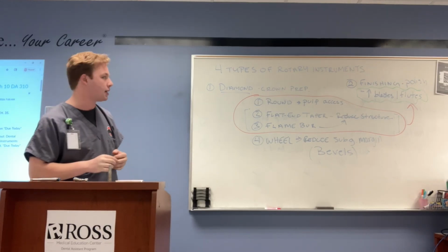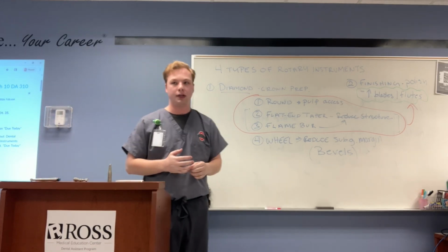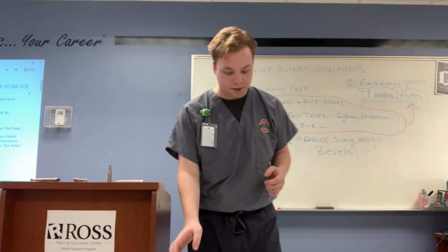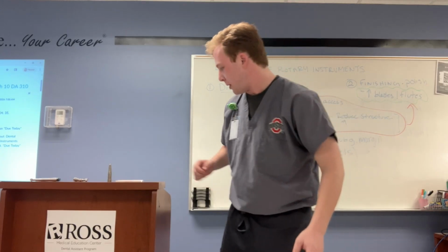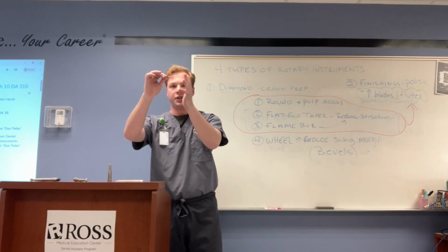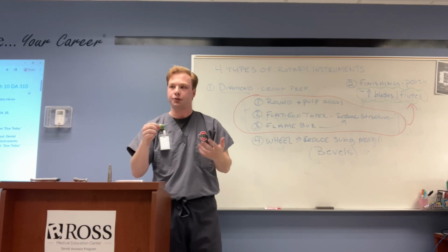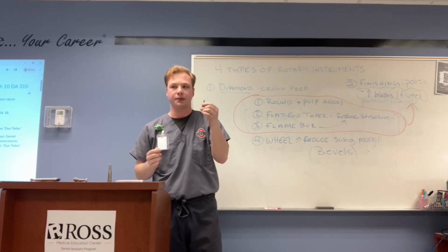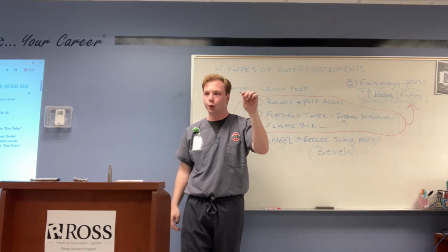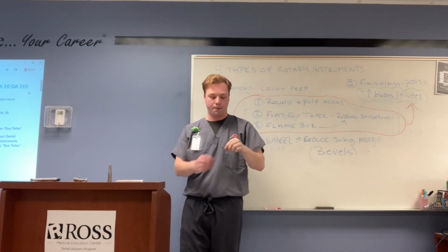The final two I want to talk about today are your abrasive instruments and your laboratory rotary instruments. So up here, I might pass around this laboratory burr. Again, I talked about the shank of the laboratory burr is increased. It has more torque to it, so it has to have more surface area to grip onto. But it's more heavy duty, more like a drill bit, if you want to think about it like that. It's a heavy duty burr.